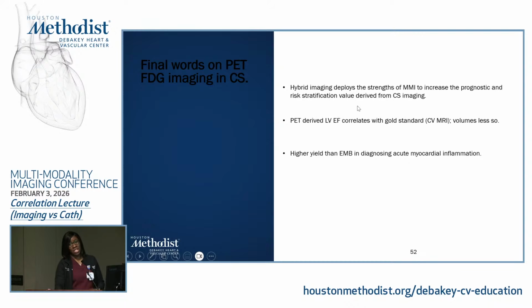But hybrid imaging amplifies what we can get and amplifies how much we can offer these patients in establishing a diagnosis, but also in following them up through the treatment journey, because this may become a lot more relevant as he then undergoes therapies and we see what becomes of his FDG activity over time and with therapies.